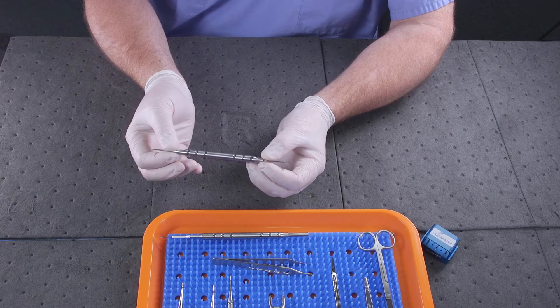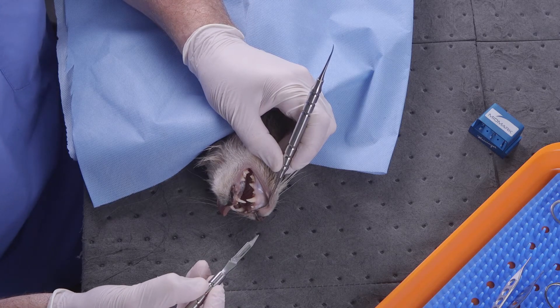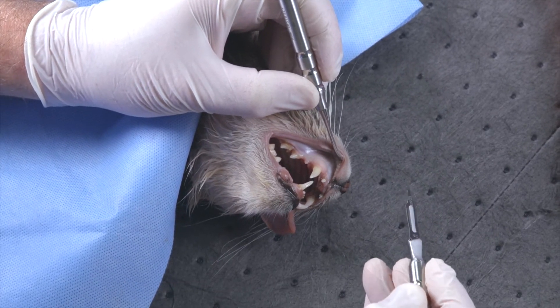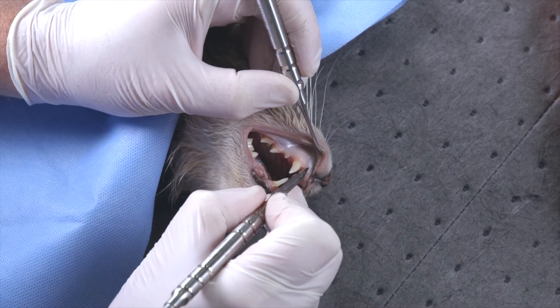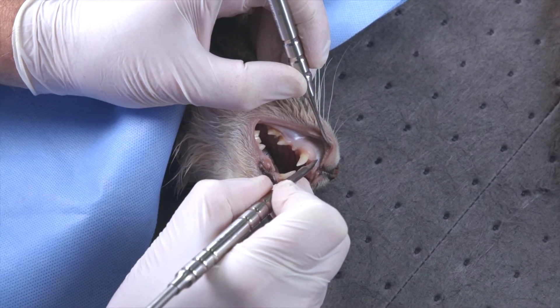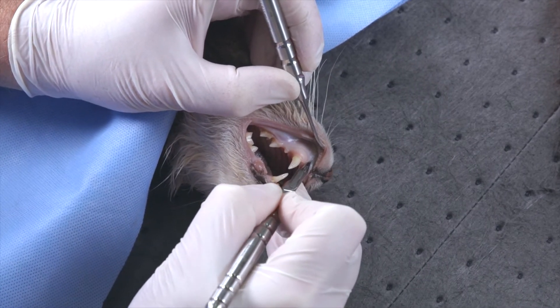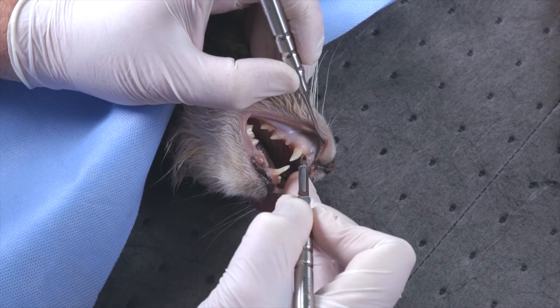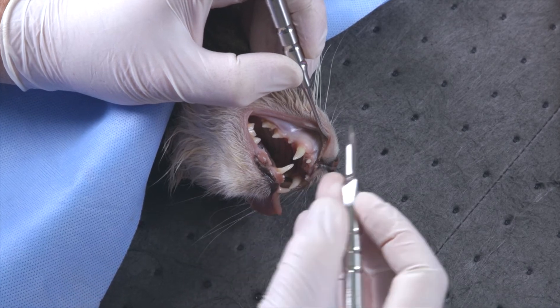Using the round scalpel handle with the number 15C blade, I'll make two vertical release incisions. The first vertical release incision will be made on the mesial aspect of the tooth, starting above the mucogingival junction, cutting boldly down to the bone with one cut and stabbing at the very end.